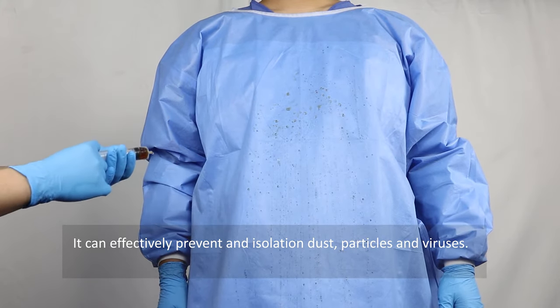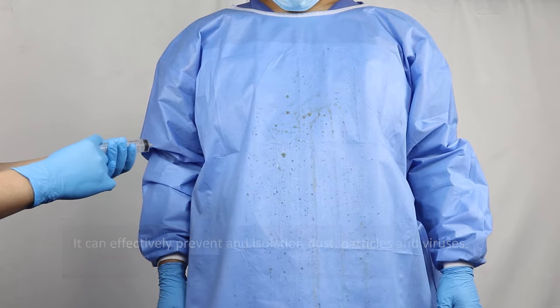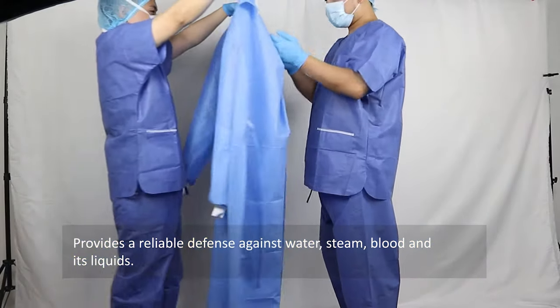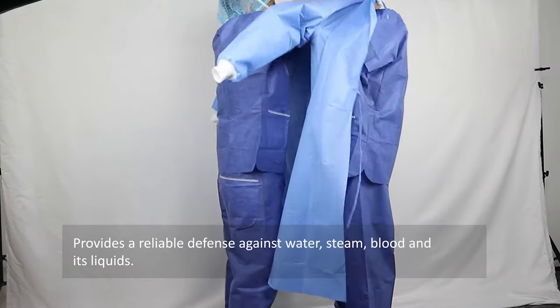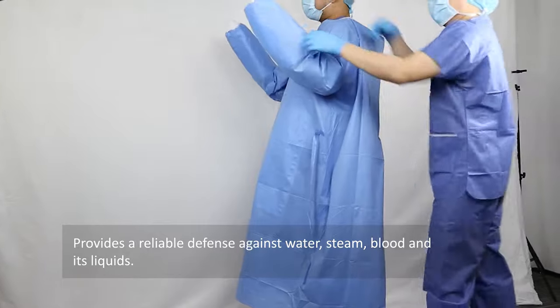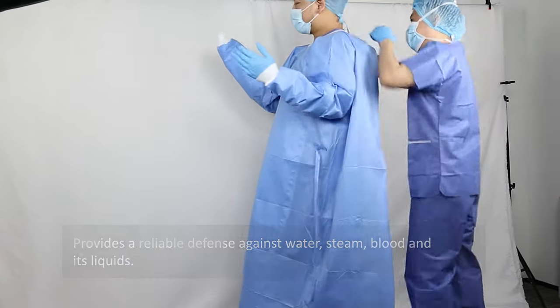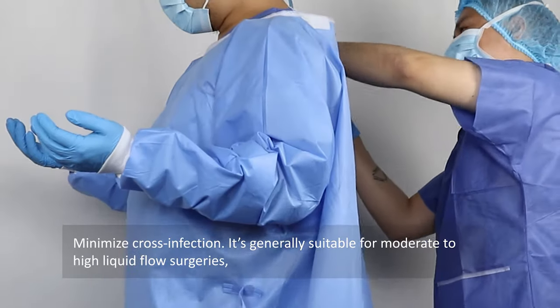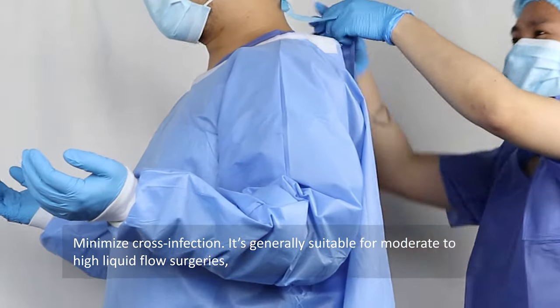It provides a reliable defense against water, steam, blood, and other liquids, and minimizes cross infection.